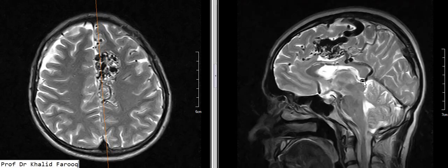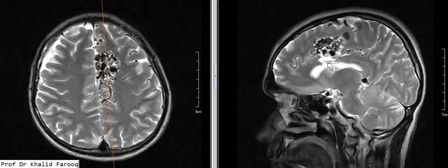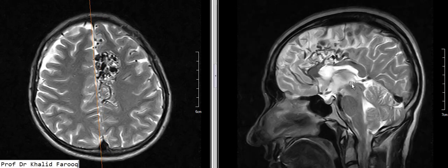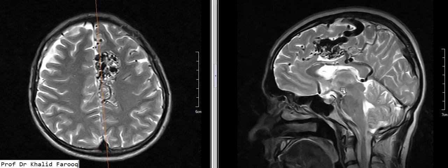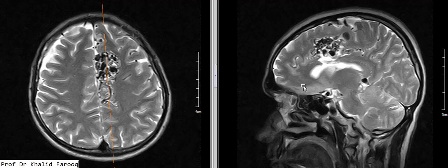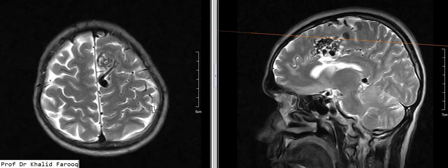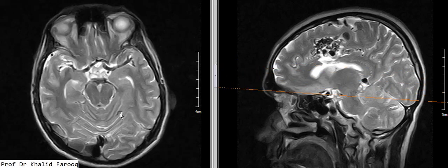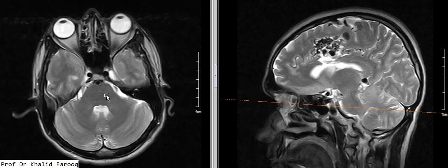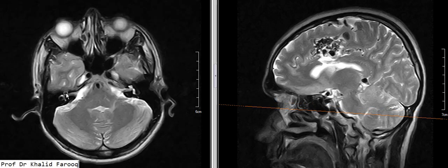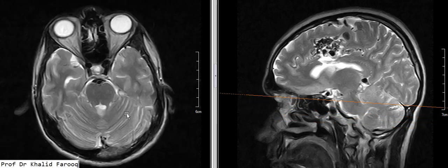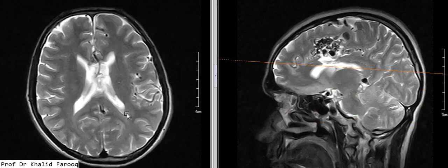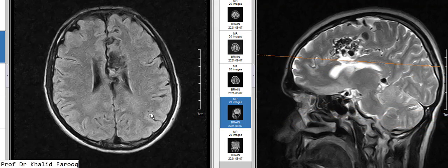We have seen there is thinning of the posterior portion of the body of the corpus callosum because of ischemic changes in this region. The remaining brain parenchyma is unremarkable. We can see the ventricular system, brain stem, middle cerebellar peduncle, both cerebellar hemispheres, and CP angles are unremarkable.